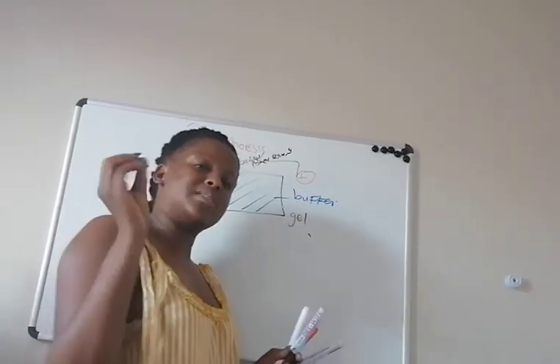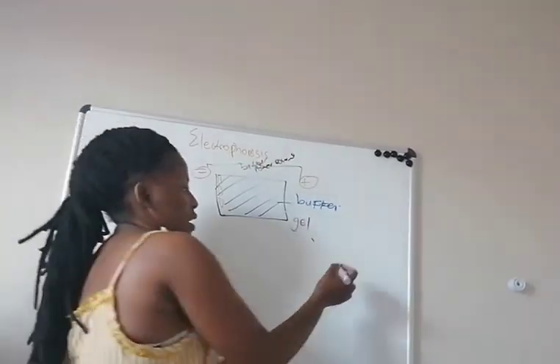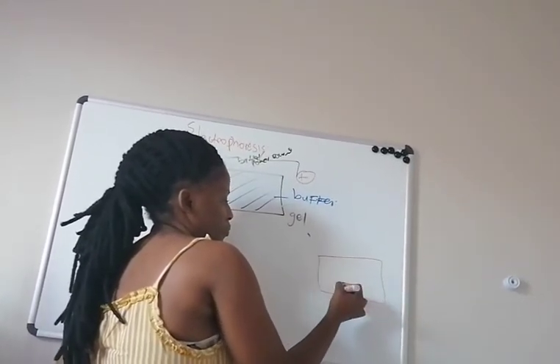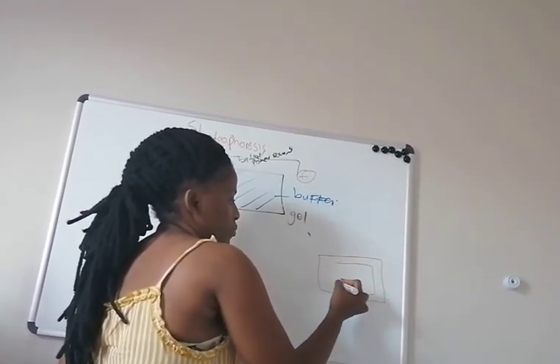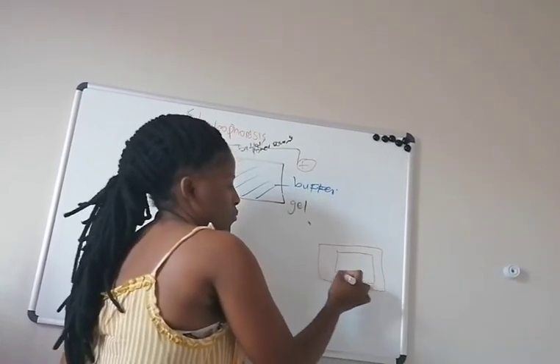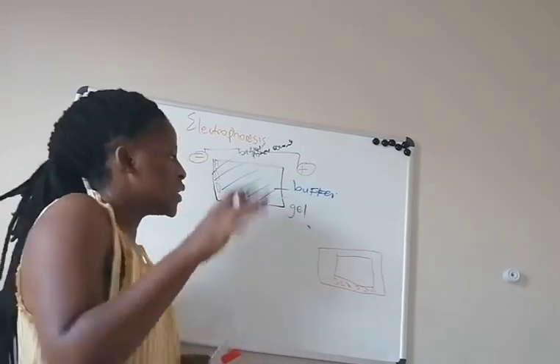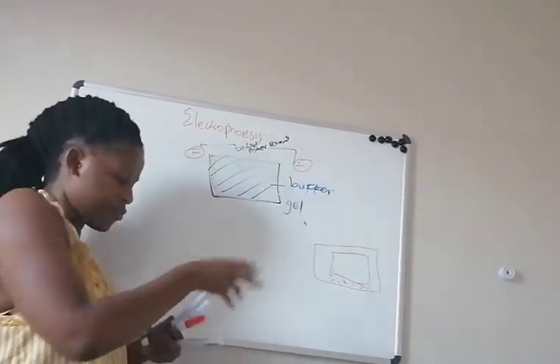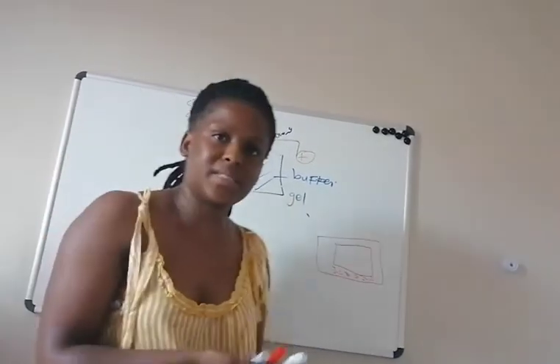And then after the patient sample, we can also have a quantification system, which is the one that is going to calculate for us. So what really happens here?